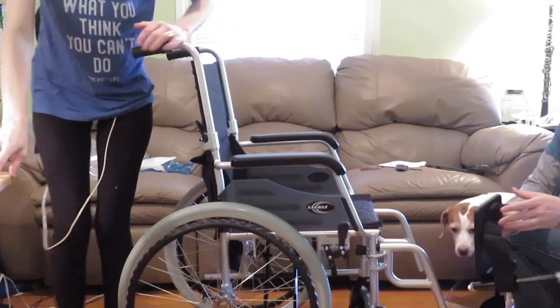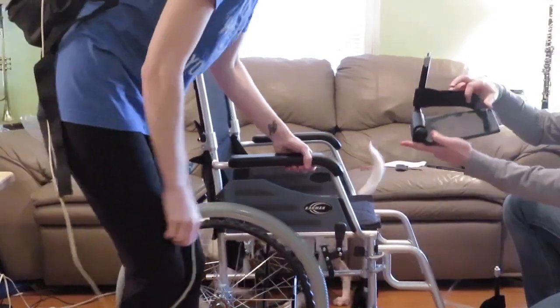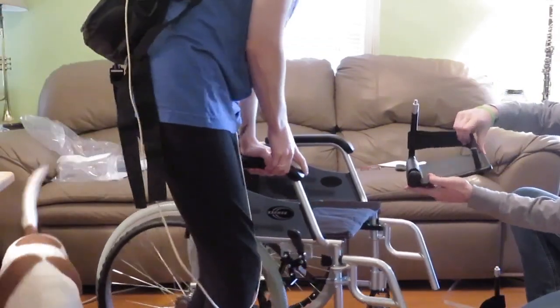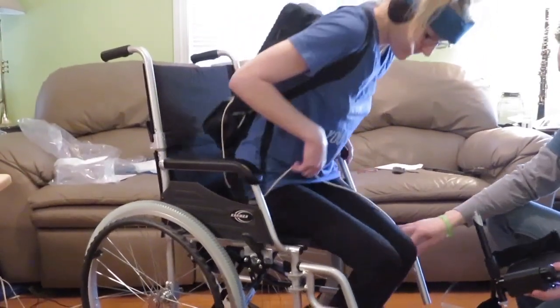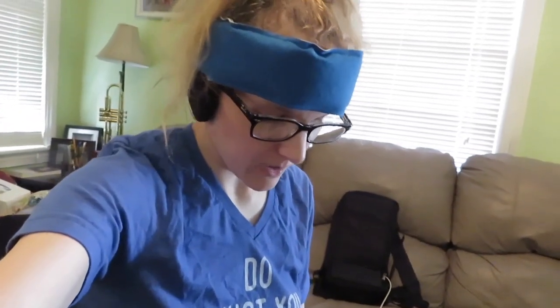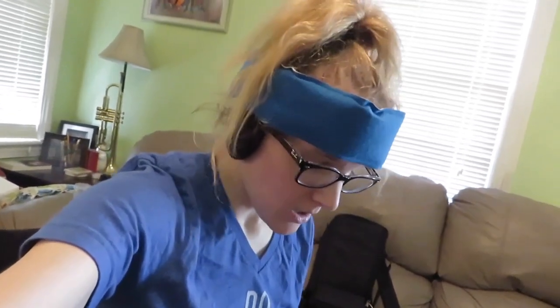All right, let's size these footrests for you. I like this feature right here — it's got a strap on it so your heel won't slide off the back and you actually rest a little bit more. So now I'm sitting in the wheelchair and we're measuring the length we need for the footrest. It needs to be a little lower — but it's as low as it goes.